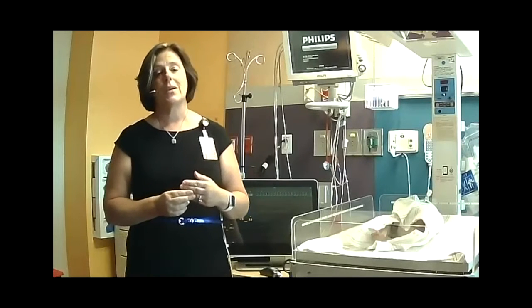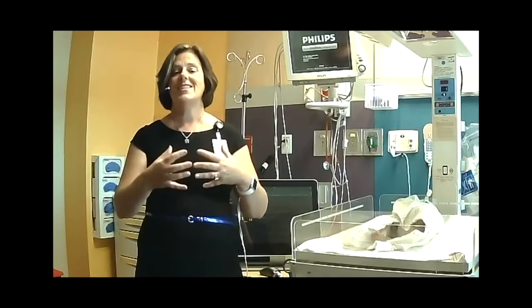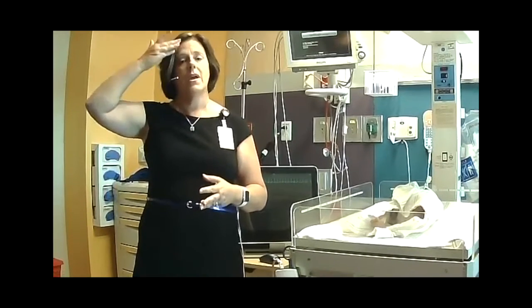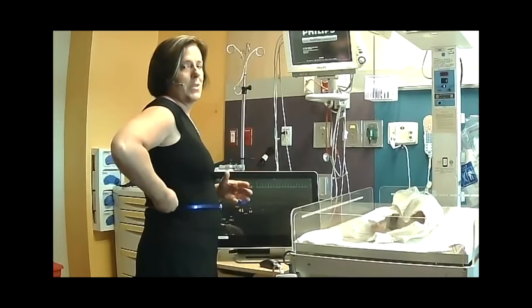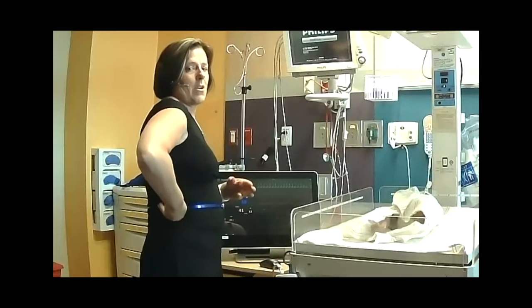So you'll see us do something that we call renals, right? Or the renal NIRS. And what we're looking at is that venous side because the body eats the oxygen. First places fed are your brain, so you might see a cerebral, we'll call it, and your heart. The heart one we measure by drawing a blood test, because we can't put a monitor on that in that direction. But other places we can look is we could look at guts and we could look at kidneys. So we'll put it on the kidney. It actually goes in the spot between the bottom of the ribs, top of the hips, not on the spine, right there. Okay, and right there, it can see this kidney, okay?